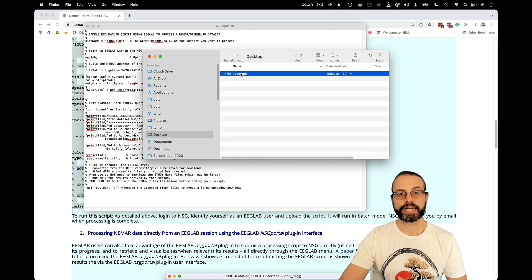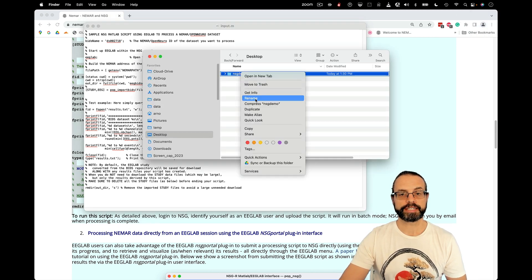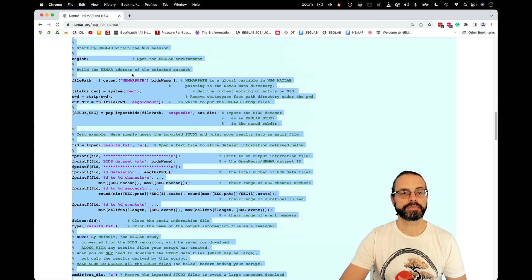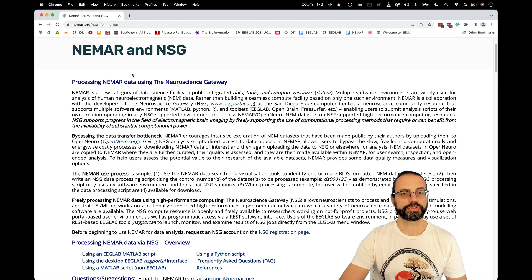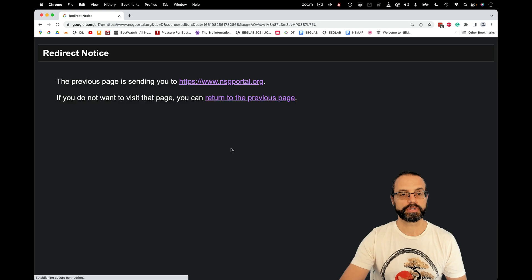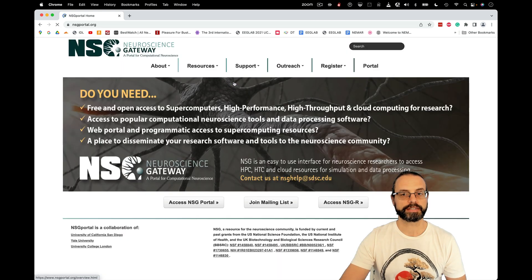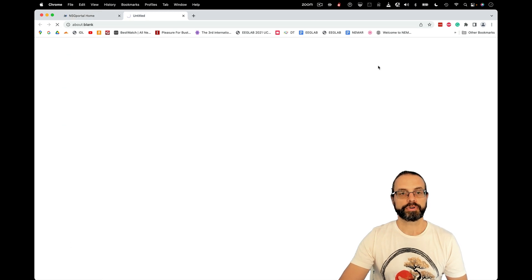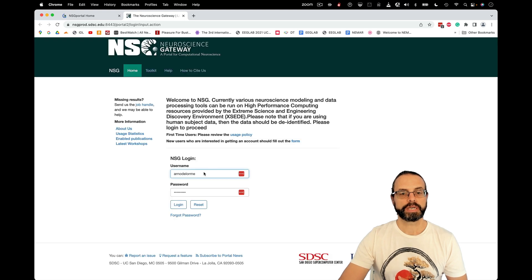First, to upload it, I need to compress it. That's done. And I'm going to go to the NSG portal. Right here. Redirect to NSG portal. Portal.